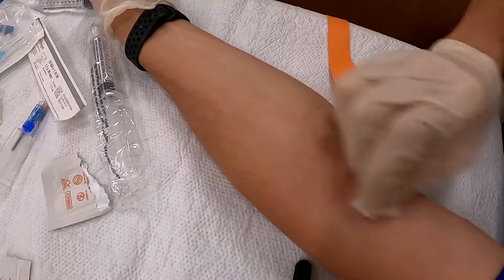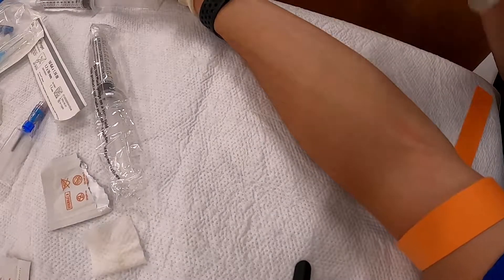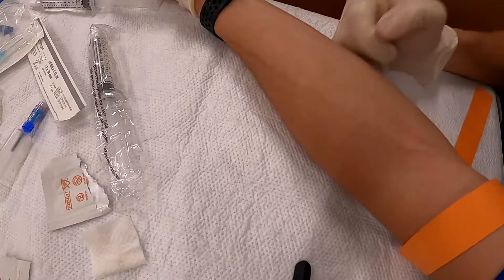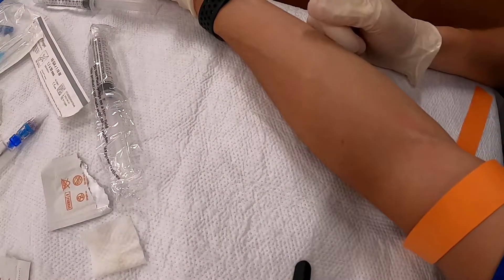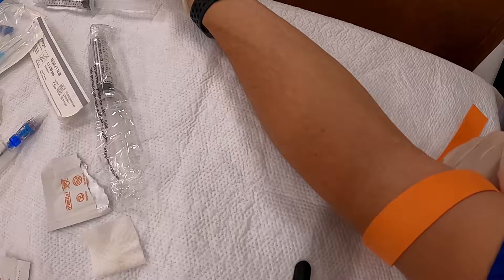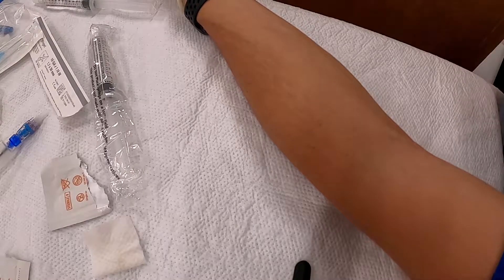Everybody loves what they can see, but over your experience you'll get better and be able to go by feel. The AC is there — it just depends on the patient. There are so many types of patients, but if you palpate around leaving that tourniquet on the minimum amount of time, or go to somebody with more experience if you think there's nothing there — watch another nurse a time or a few times, then ask for chances to start the ones you think you can get. You won't get them all but you'll get better and better.